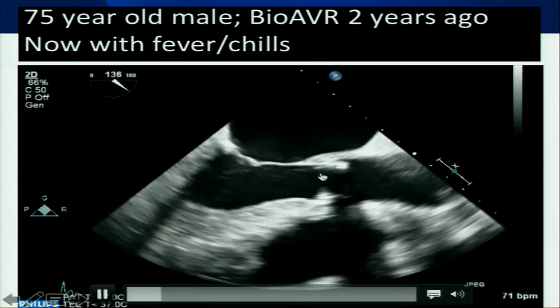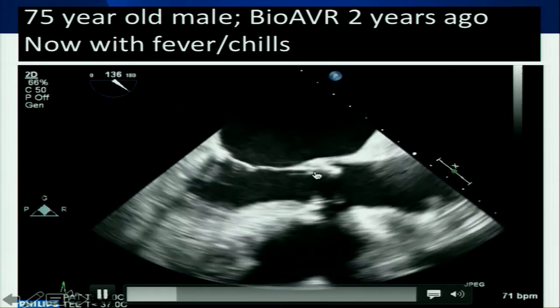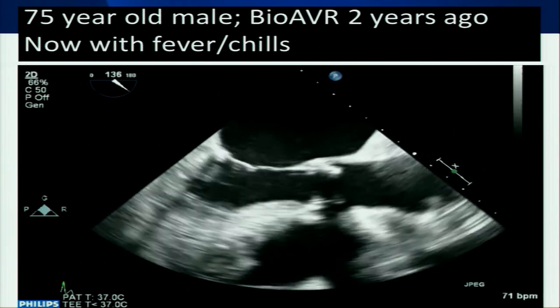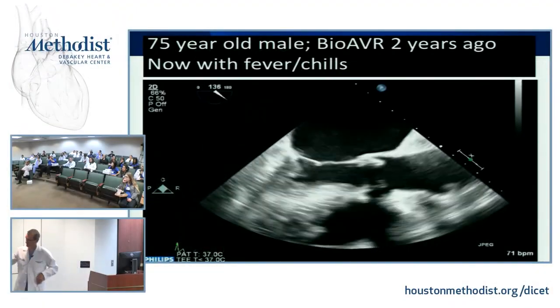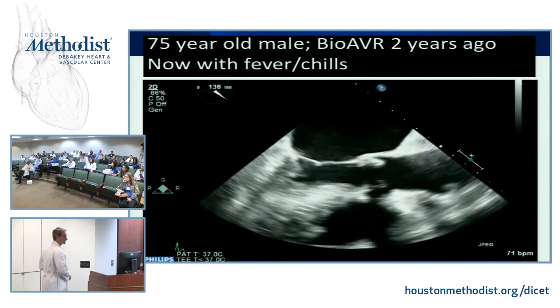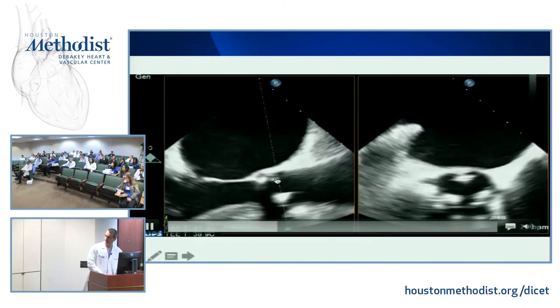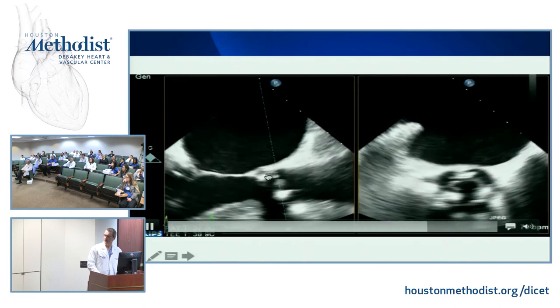I was going to say that area looks a little thicker. It's suspicious. This is the kind of TEE you would want to repeat in 10 days, and that is what happened. This was not called, but it was recognized as suspicious. Come back in 2 weeks on antibiotics. He came back in 2 weeks, and now it's pretty definitive. It's expanding on antibiotics. That's a new abscess.